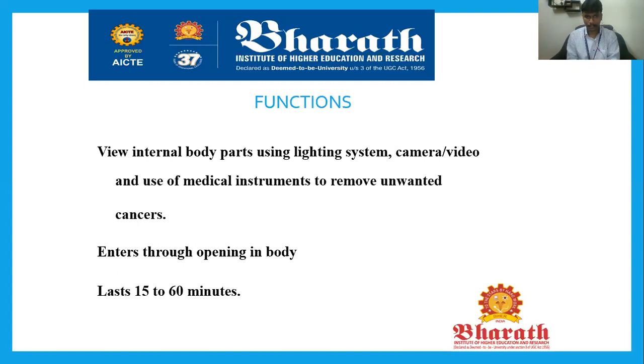So endoscopy is used for both medical imaging and medical surgery. Endoscopy is a vital key in modern healthcare for proceeding with medical imaging as well as surgery.